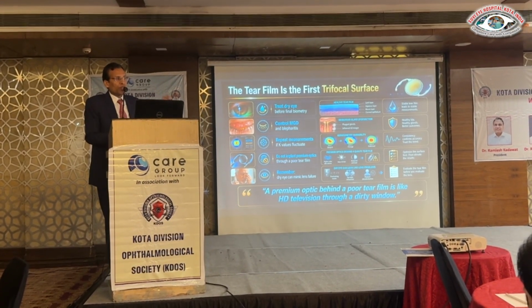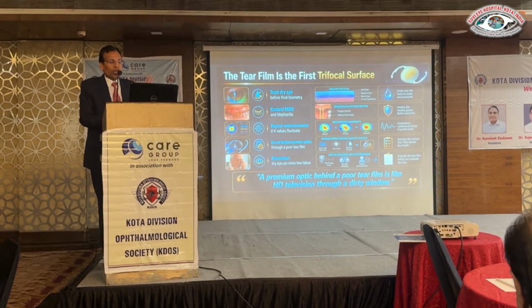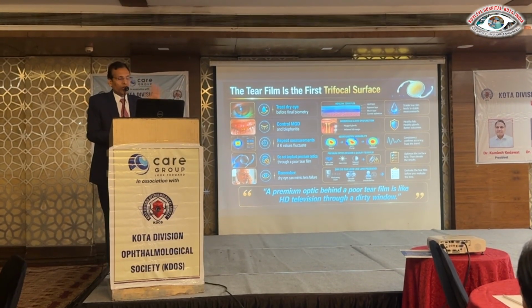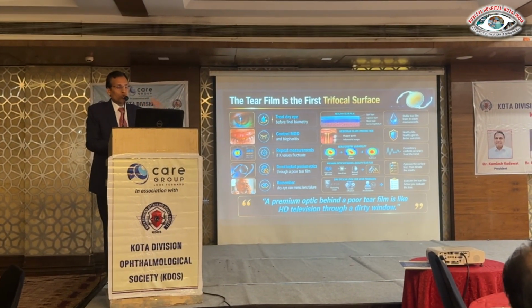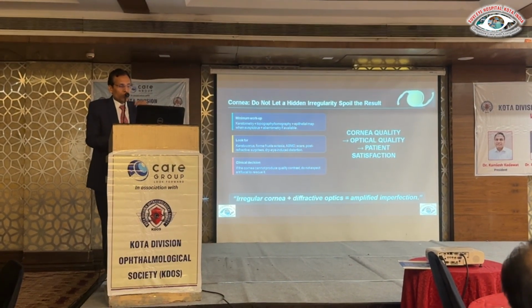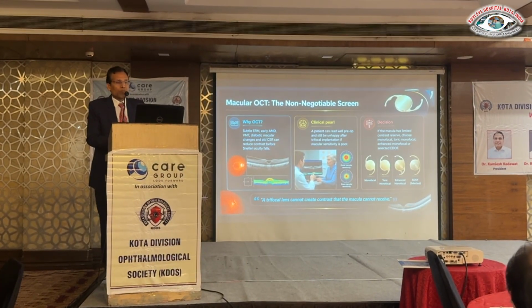And remember, dry eye can mimic lens failure. It's very important that if there is a variation in the K reading, or keratometry reading, always try to treat the dry eye first. Repeat the K reading until it is consistent, and use 2 or 3 pieces of equipment to take the K reading. So it's a very important aspect for any success in premium lenses.